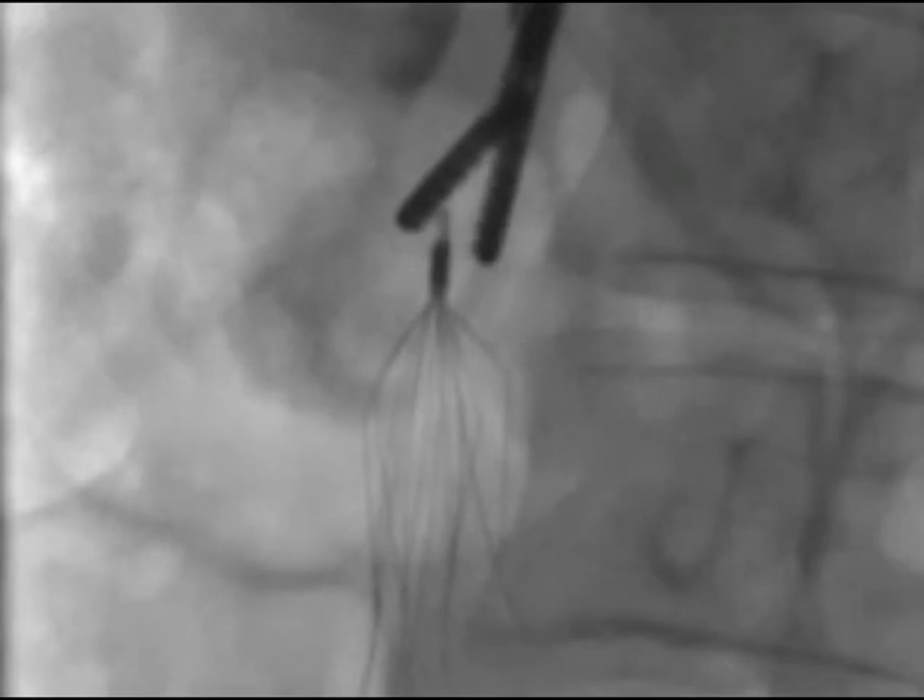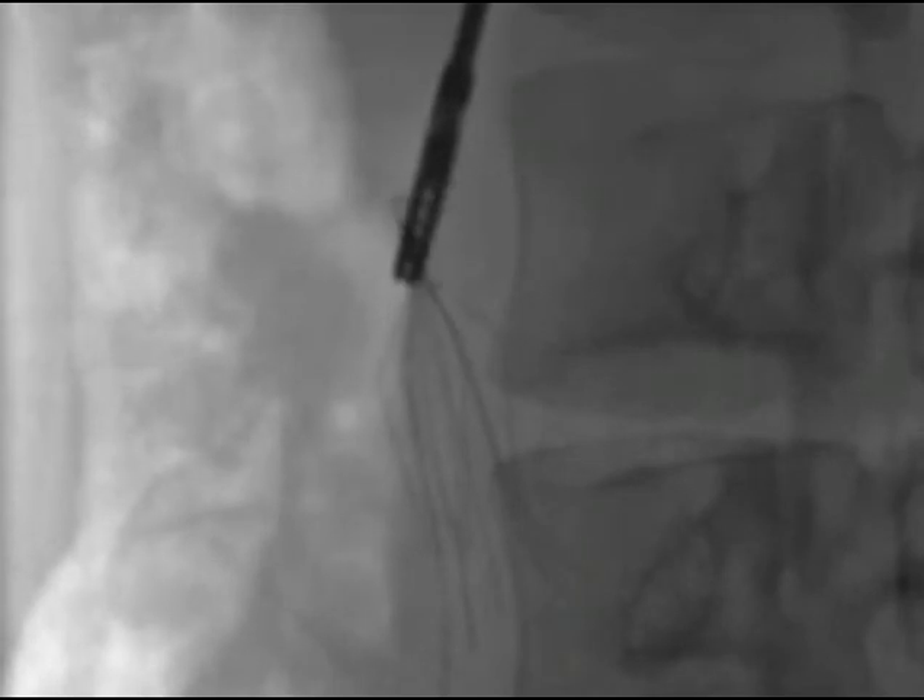Once the forceps have been inserted through the sheath, the operator uses a combination of torquing maneuvers and opening and closing the forceps in an effort to feel the tip of the filter within the forceps. Through this process, the operator will begin to feel metal on metal, which is a sign that progress is being made. If the initial rotating maneuvers do not result in at least partial contact with the head of the filter, the operator should withdraw the forceps and bend them further or less in order to get better contact.